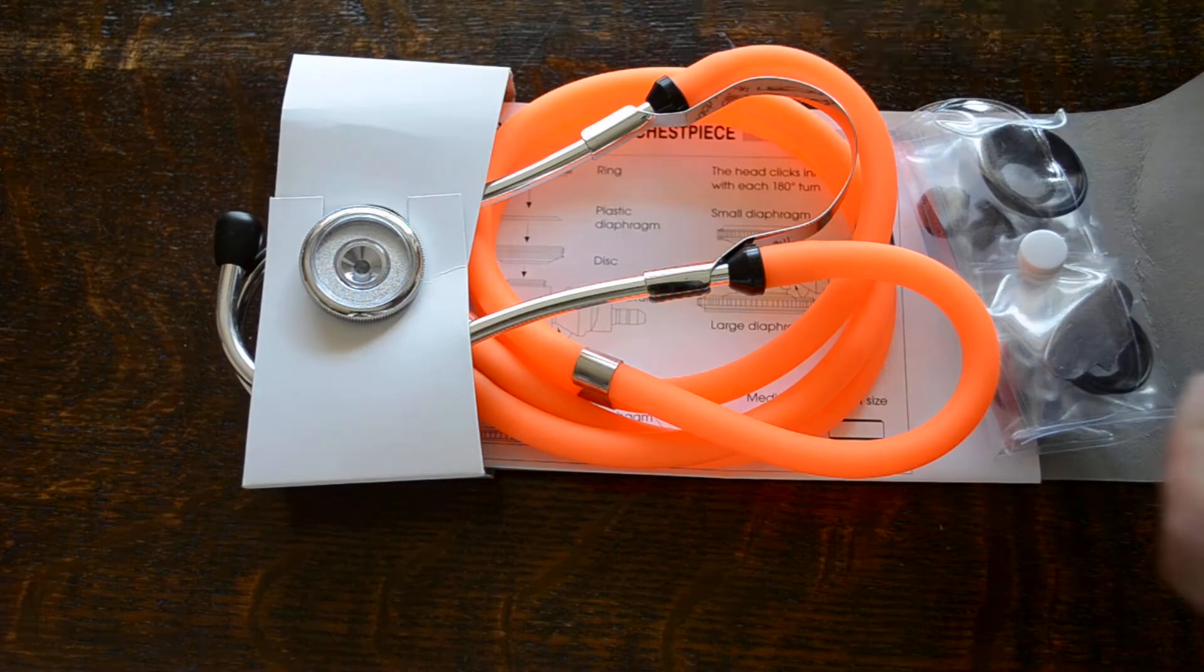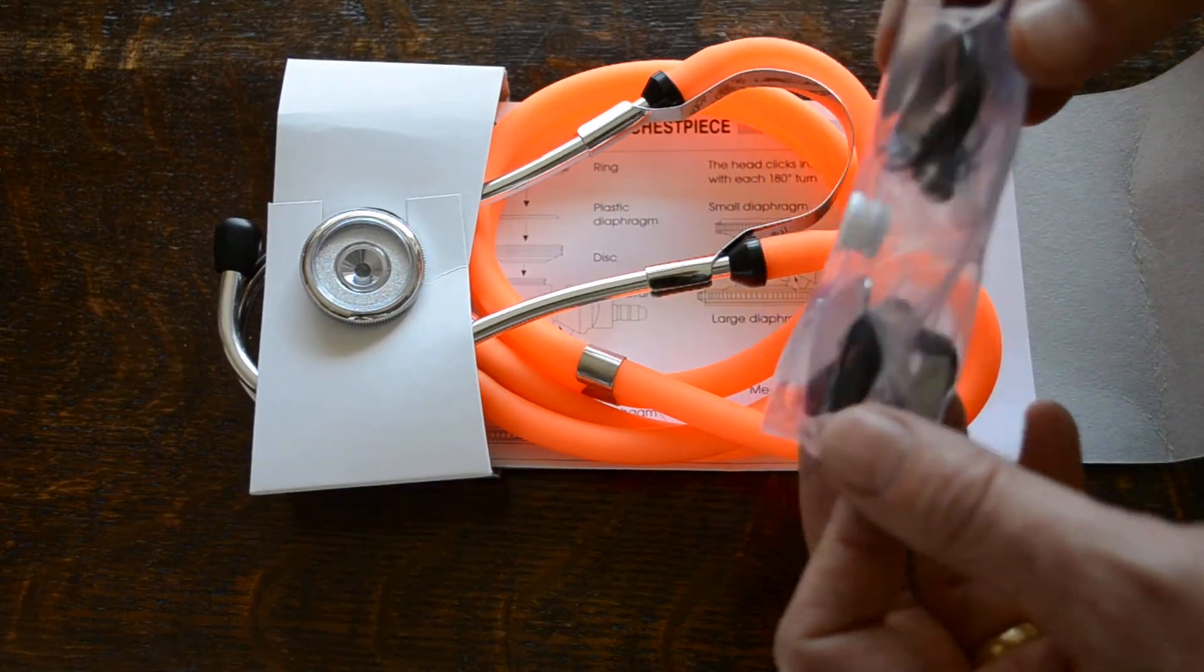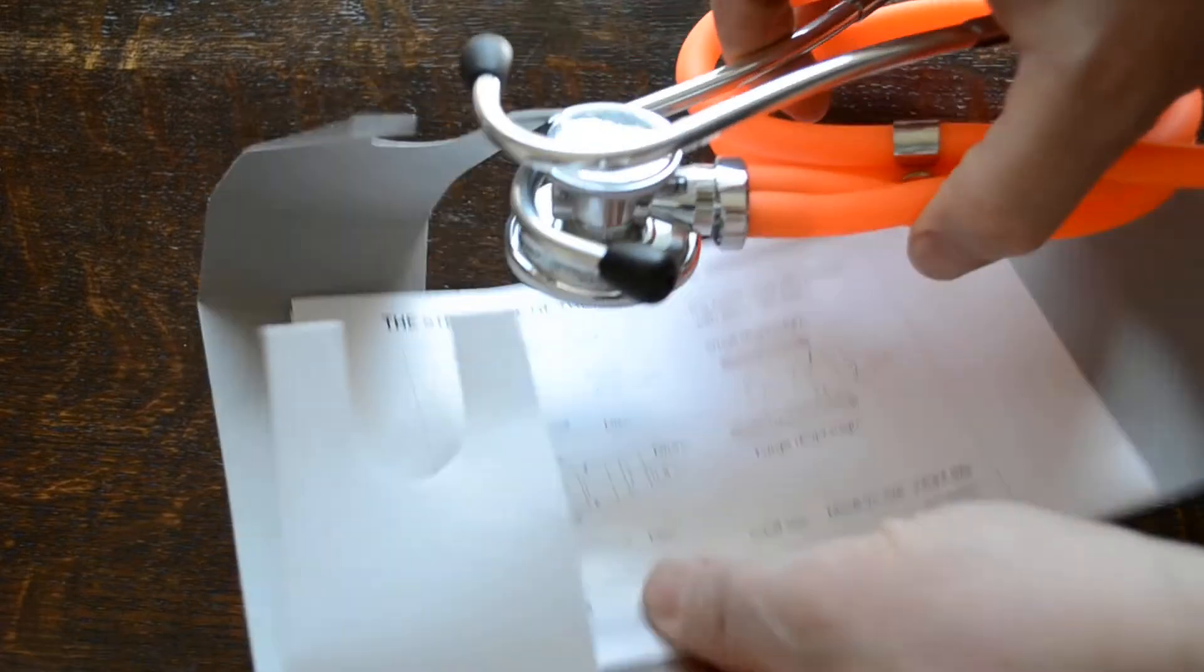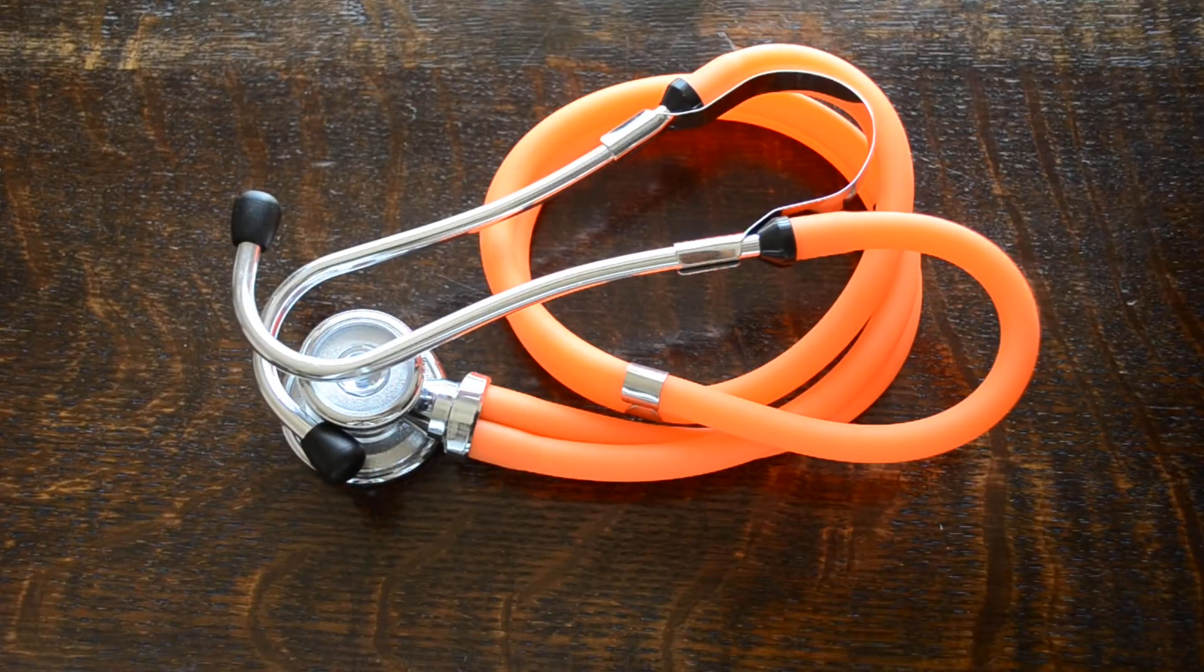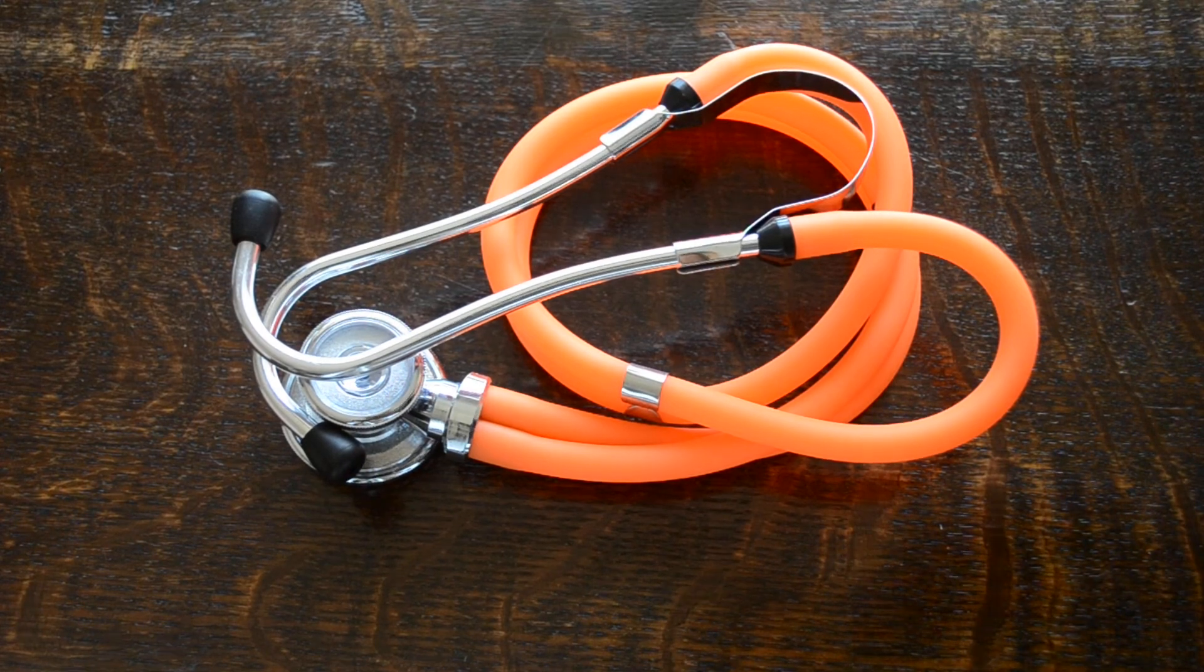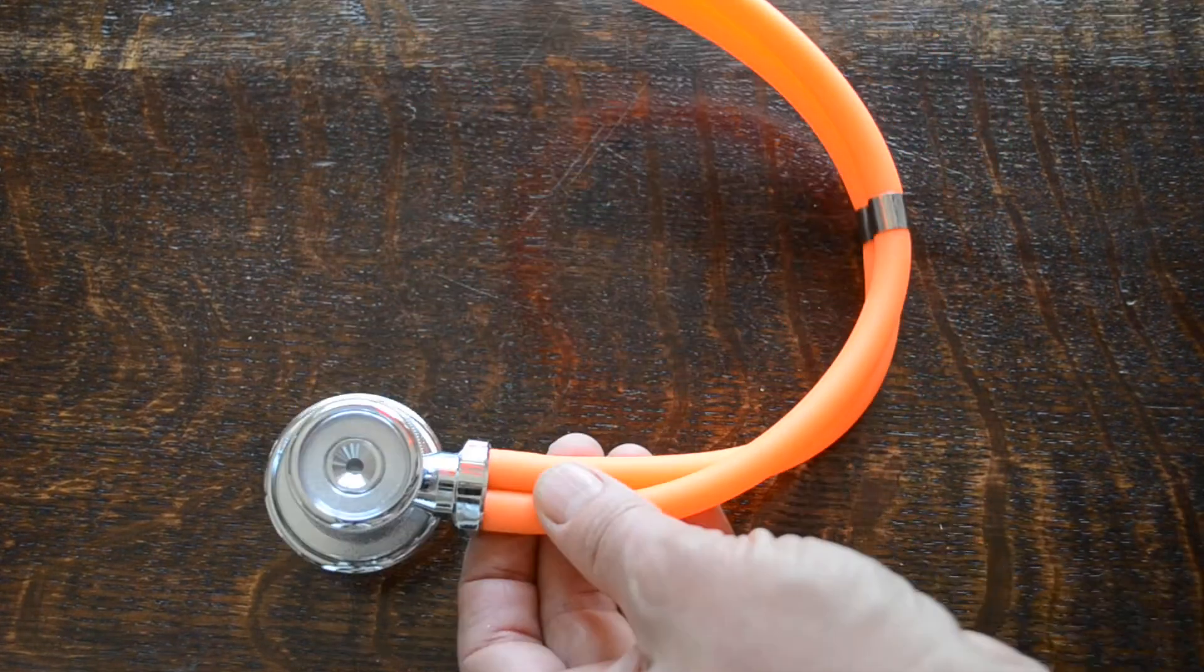Let's just open this up and show you what you get. Pack of spare parts which we'll come to in a minute. Just take this out of the outer. Retain the pack insert. We'll come to that again in a minute. Let me just show you the stethoscope first off.